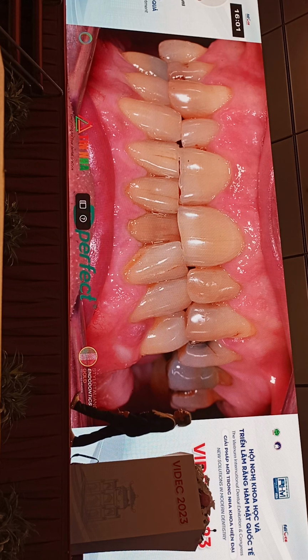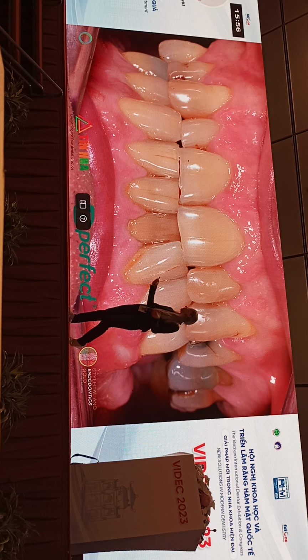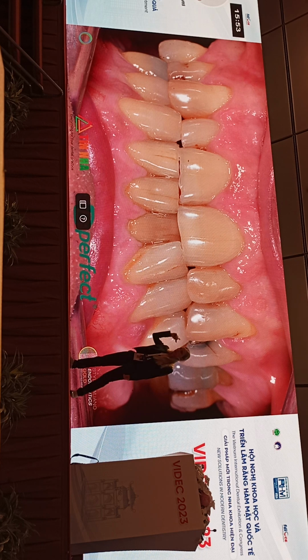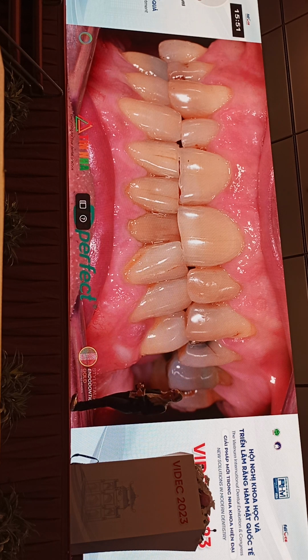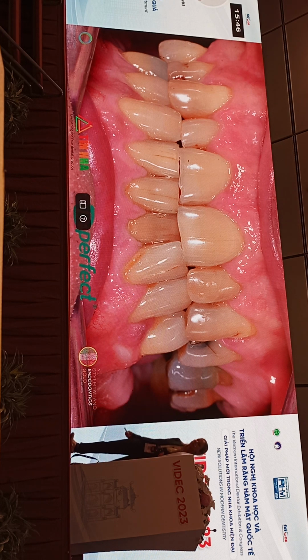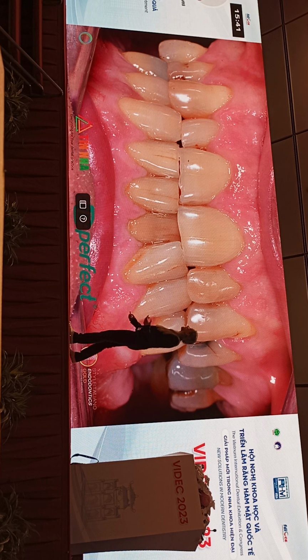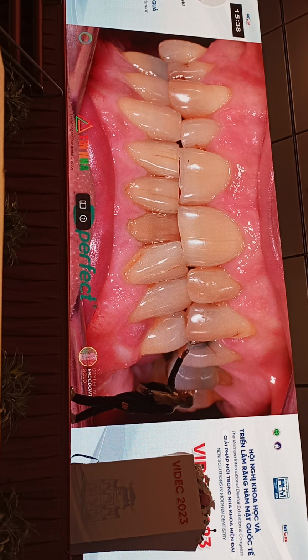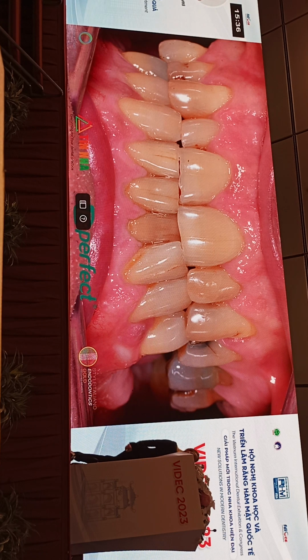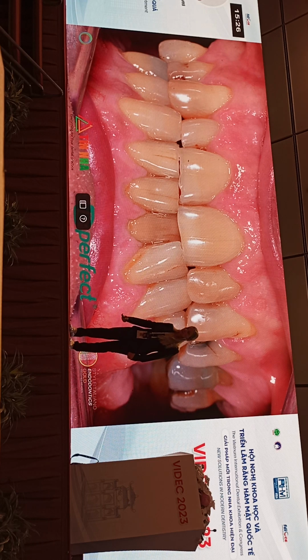This is an example. This is a patient who requires a huge rehabilitation because he has lost vertical dimension, he has lost the molars, he's a bruxist, he has clenching, so he needs a big rehabilitation, and a colleague of mine does the rehabilitation. And he decides that he wants to do the endodontic treatment on the two lateral incisors. But he is no endodontist. He takes a panoramic X-ray as a preoperative. And so he doesn't see the anatomy of these teeth.